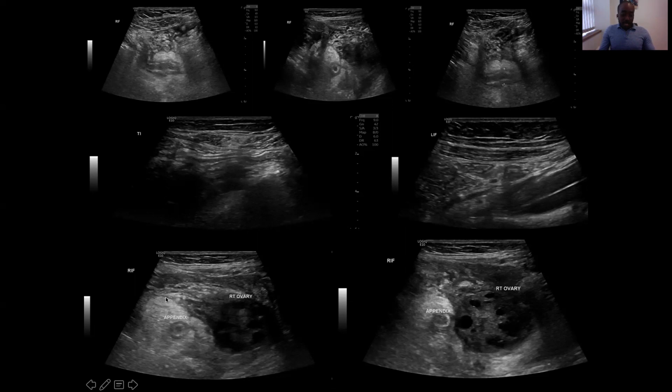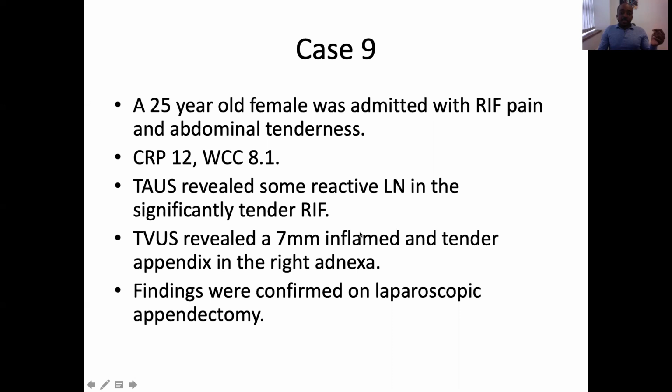And here again we have down into the pelvis. Because she was quite slim, we could use the 9 megahertz frequency linear transducer to image the pelvis. It was a beautiful image of the ovaries with normal follicles there. I can see the appendix just next to the ovary there, which might have explained why the gynecologist would have anticipated a gynecological abnormality. But the ovary looked normal on ultrasound. So this is a case that also highlights the use of ultrasound in examining the appendix and the bowel.